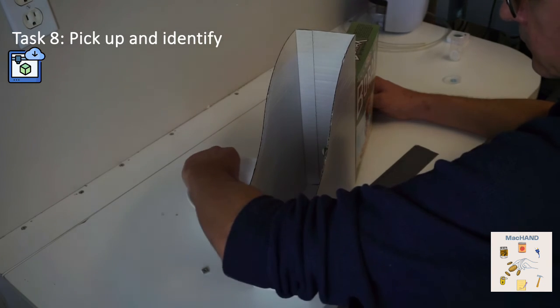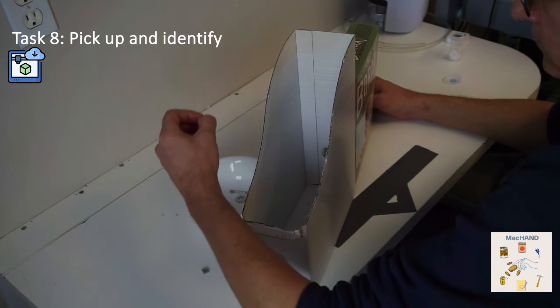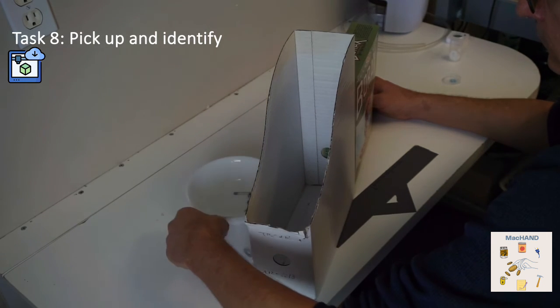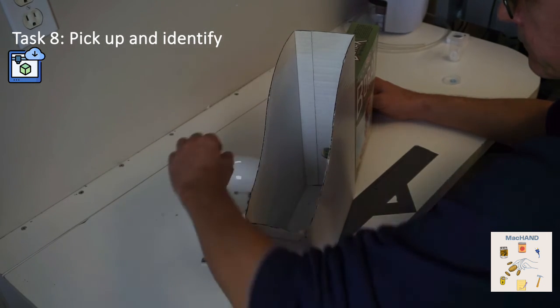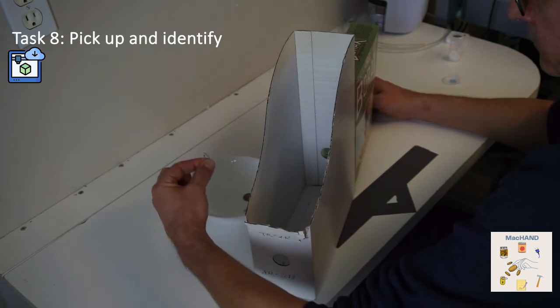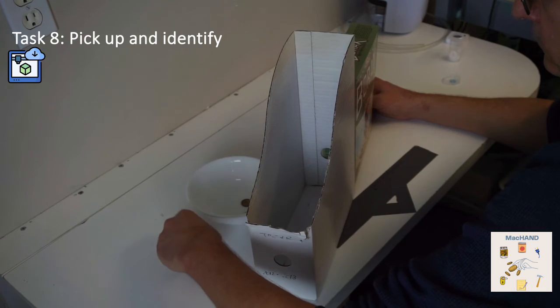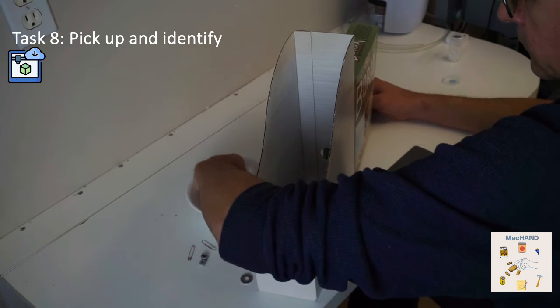The assessor should not say yes or no to indicate if the patient is correct. The assessor's focus is on dexterity, sensation, and stereognosis. The patient should not slide the object on the sides of the bowl when picking them up. We strongly encourage you to 3D print these items as some of them are very difficult to find, like the square nut.